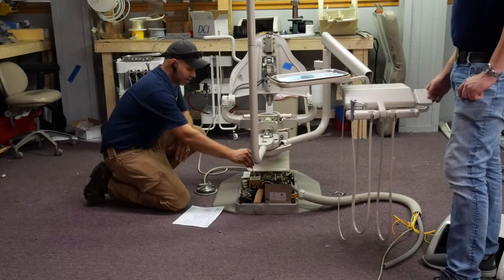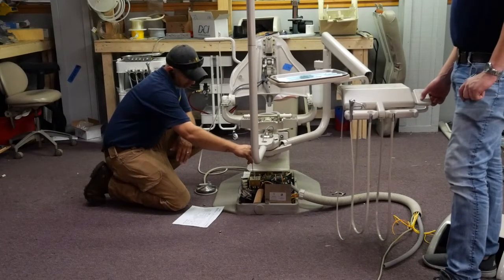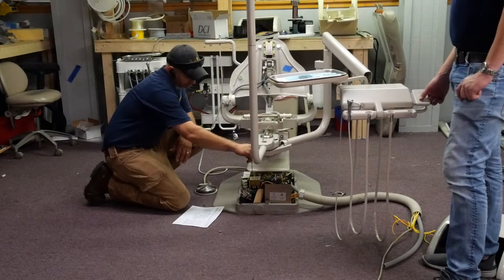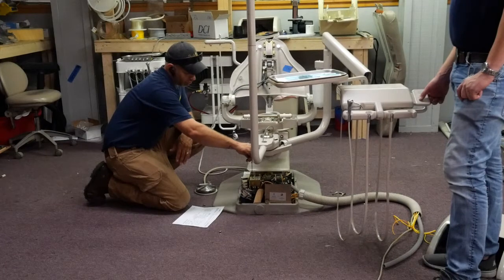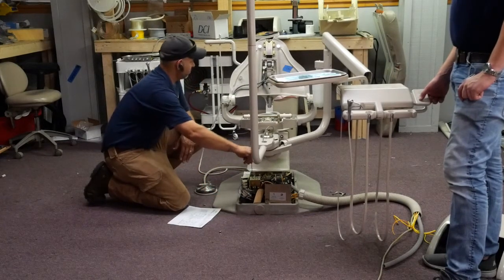And then the back up and down, we'll go ahead and adjust the, what's that? That is the back. I guess we'll do the back down first. So we'll turn that. All right, go ahead.